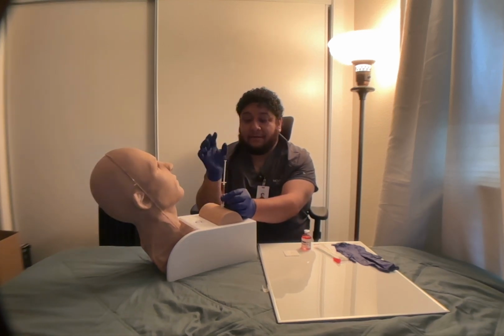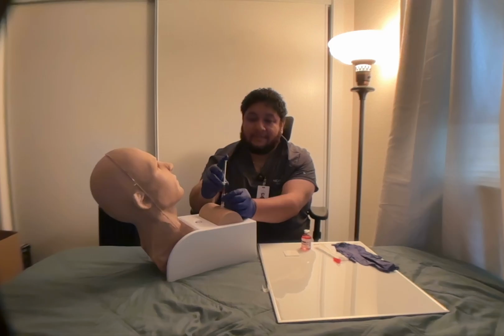Now with my dominant hand, I'm gonna go ahead and start pressing the plunger slowly.